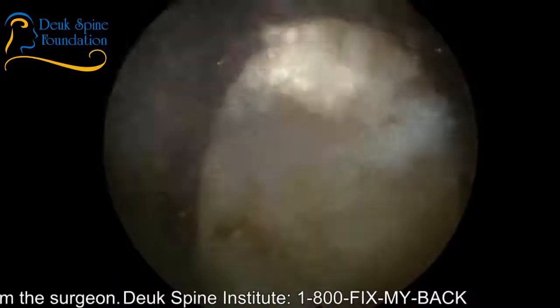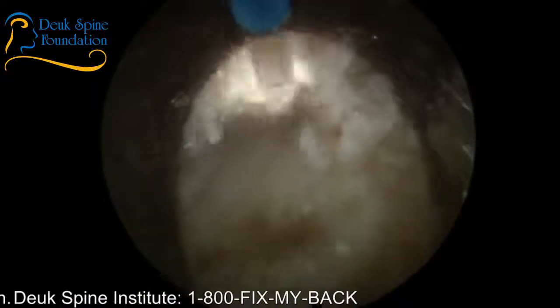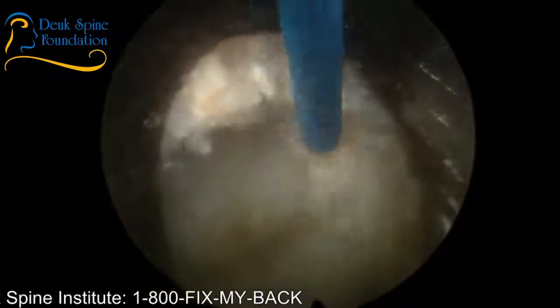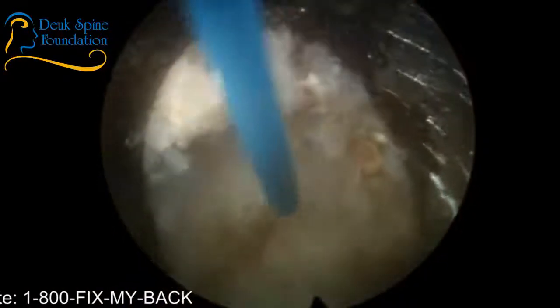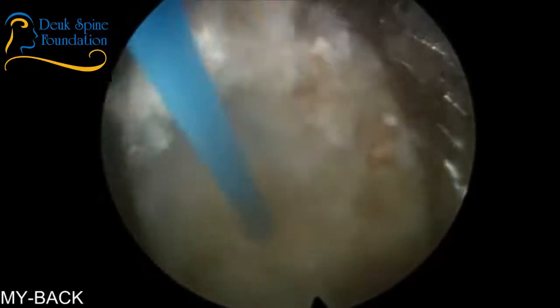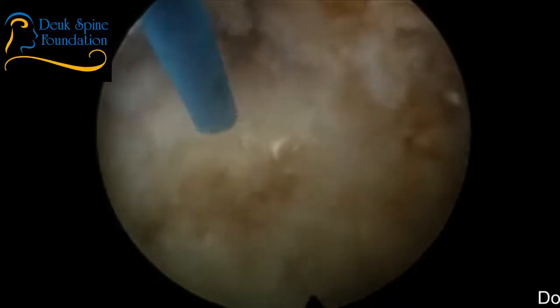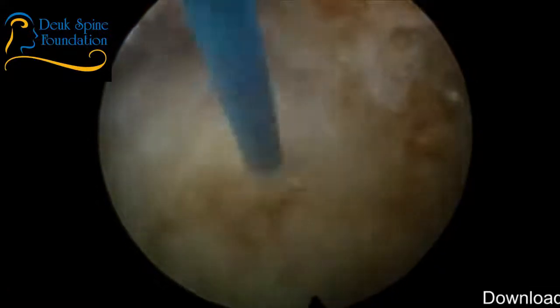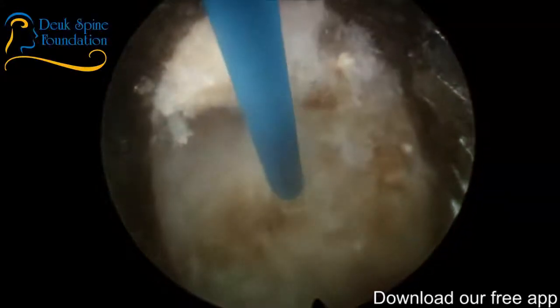Well, all right, so at 12 o'clock, what I'm zapping is something called the foraminal ligament, which is contributing to the narrowing that's pinching his nerve. And then right where my laser is now, I'm inside the disc herniation. And I'm taking out as much of it as I can, but I'm limited based on my trajectory.